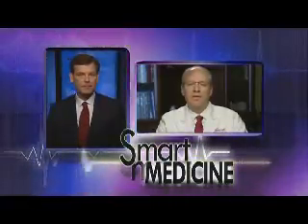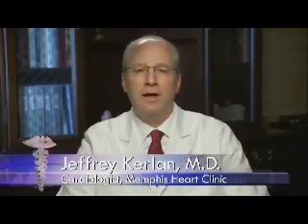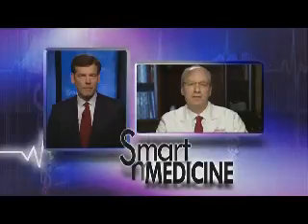The wireless defibrillators are really an incredible new technology with device therapy, specifically as it regards to heart rhythm management. The devices have really become pretty commonplace within the past 3 to 4 years, and they have the unique ability to allow us to communicate with devices without requiring any real true contact in terms of a hand or even a direct piece of equipment with the patient. Wirelessly, we're able to talk to these devices because they have equipment within them that allows us to communicate remotely to those devices and provide really just an incredible amount of information.